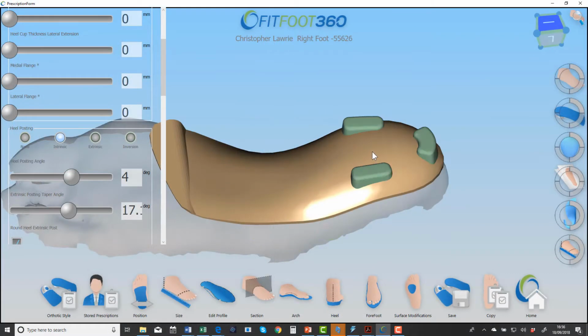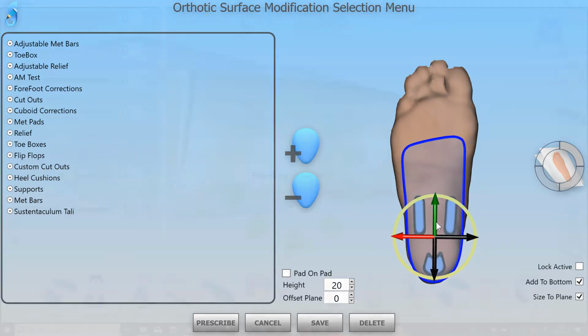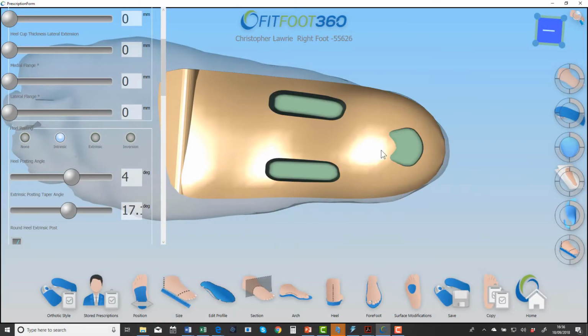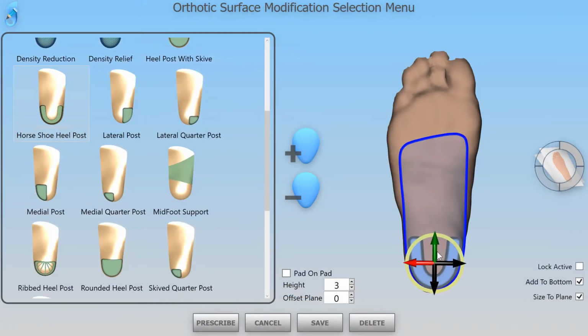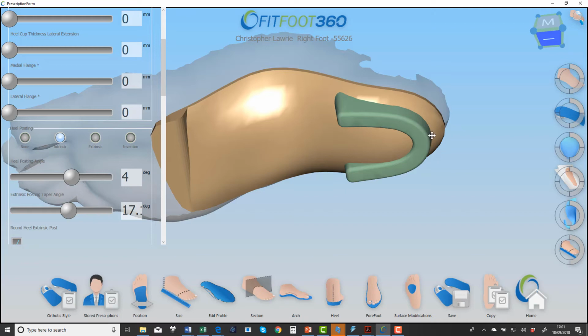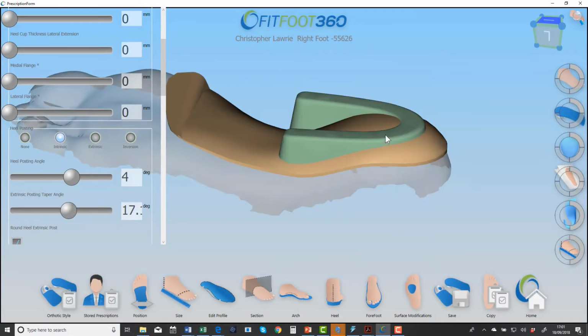So for example here a tri-post, you could use that in its current form or you could adapt it. So 3D printing gives you choice, it gives you the ability to think differently about how you make things. And within reason you can make almost anything you like. The most important thing is you don't make decisions that are going to make the device weaker.